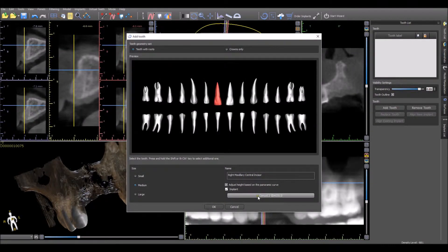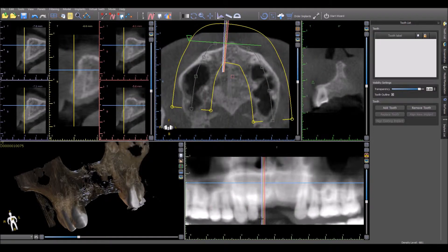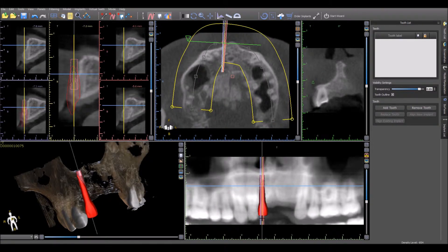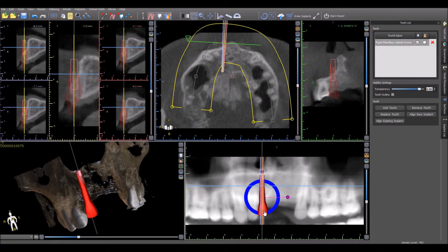The previously used implant in this functionality will be shown by default in the box. After selecting the correct tooth and implant, press OK and left click in the view where you would like to place the virtual tooth. As you can see, the virtual tooth now appears together with the implant.